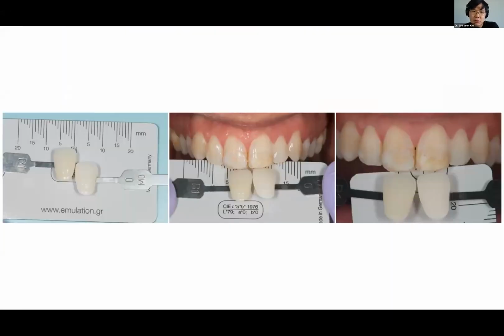So here's another example. In this case, I actually turned the gray card sideways. If you look here, there are these small dots, and this is actually a distance indicator. If you're using an FX camera, like a full frame camera, you see those little round things when you look inside the viewfinder. Those round circles, if you match them up to here, it's the right distance, because your shade could change depending on where your flash systems are. And this is for the DX cameras, which is a good indicator for distance.